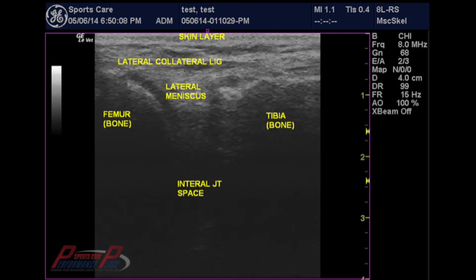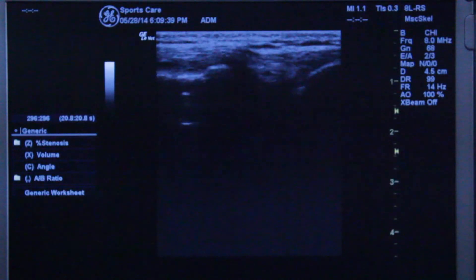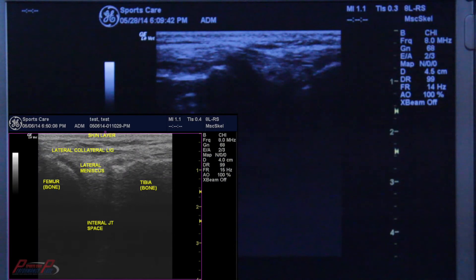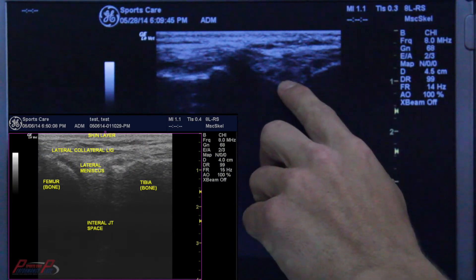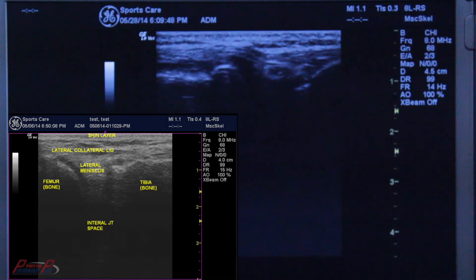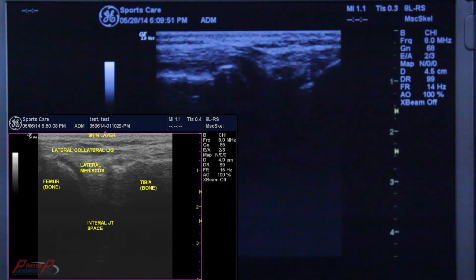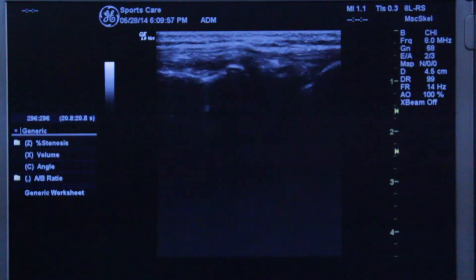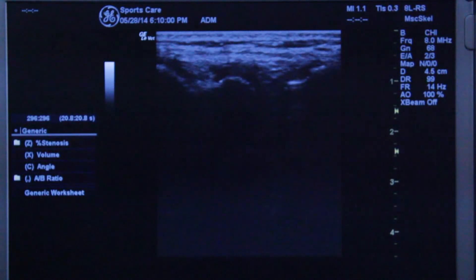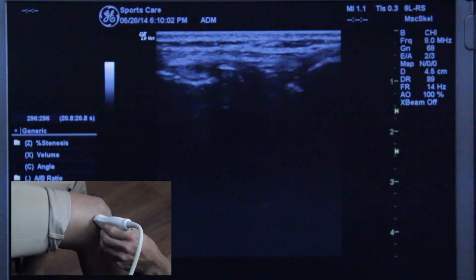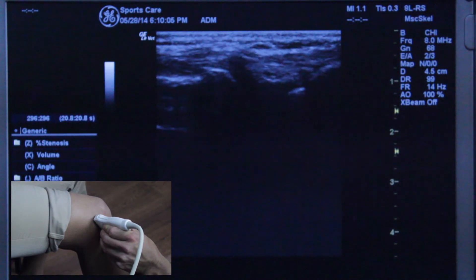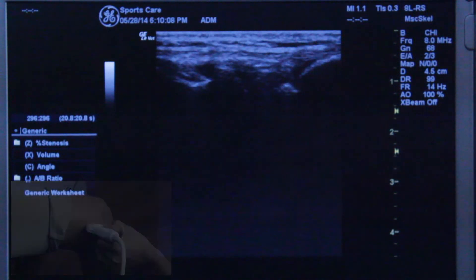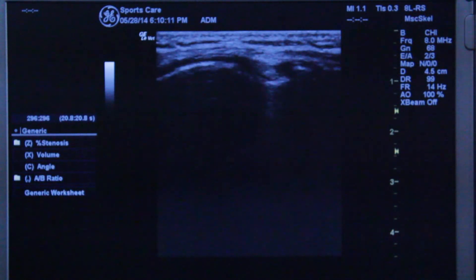In this MSK ultrasound of the knee, we want to show you the relative depth of the lateral meniscus in relationship to the other structures we talked about — the IT band and the popliteus. You can see I made this wedge here, and that wedge is a representation of the lateral portion of the meniscus, or the outside part of the meniscus. Just above it is the LCL, and if I move backwards you can see the LCL is really in the same plane as the IT band. So they're in close relationship to each other. Here's the lateral meniscus — that wedge — and then the IT band is right on top, along with the popliteus tendon.